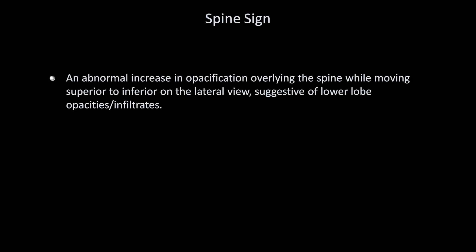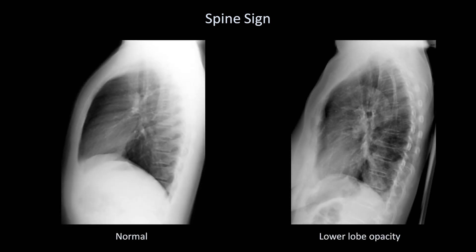Another helpful radiographic sign is the spine sign. This refers to an abnormal increase in opacification overlying the spine while moving superior to inferior on the lateral view, suggestive of lower lobe opacities. On a normal lateral film, there is a progressive increase in lucency moving inferiorly, such that the vertebral body just above the diaphragm is the darkest. An abnormal film shows increased opacification at the inferior-most vertebral bodies, suggesting a lower lobe opacity. It is not possible to tell from the lateral alone whether this is right or left lower lobe.